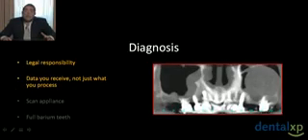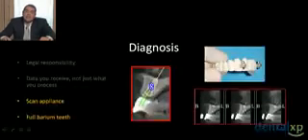In terms of diagnosis, here's what we have to remember, something that's become critical: a lot of us are taking these images within our office, and we have a certain legal responsibility relative to this data, meaning that we're responsible for what's going on in this image, even if it's not in the image that we process. So we're responsible to review all the information, identify the potential for pathology or other problems that are within the images, not for what we process, because remember, we may eliminate some data, but for all the data that we actually acquire. So we need to review the information not after processing. We need to review the information after image acquisition, prior to processing for this indication.